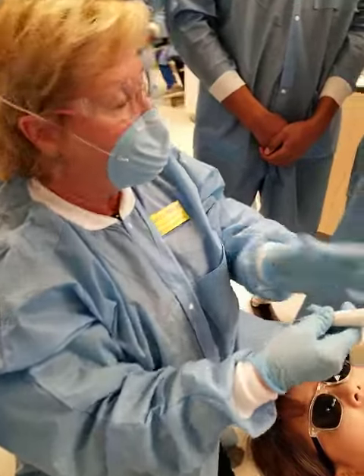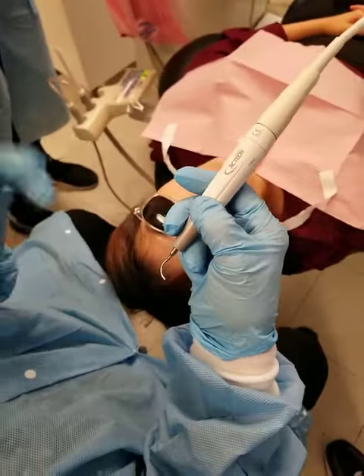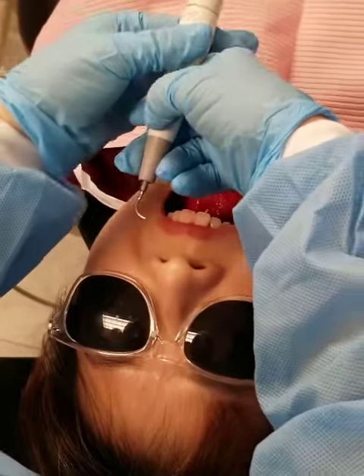Pretend like this is your terminal shank. There are three tips. I don't like the thicker, straight one — I think it's too big and bulky. I like the two curved ones; they're kind of thinner. So I'm going to try to figure out which end to use for my upper right.